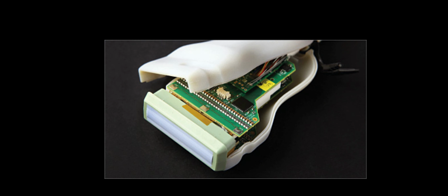What this will do is the machine will create a screen that's reflective of the kind of sound beam that is being thrown out by your transducer itself. So in the case of a curved array, that sound wave is sent out, it's reflected and it comes back. The machine then by inference says, okay, that's the speed of sound in soft tissue. I'll generate that impulse and I can interpret that as being that far away from the transducer itself.